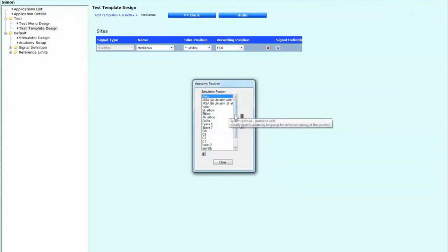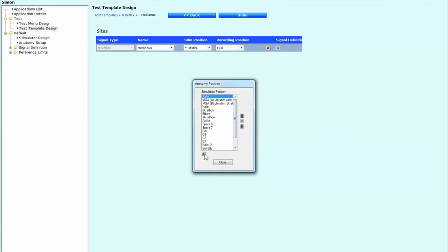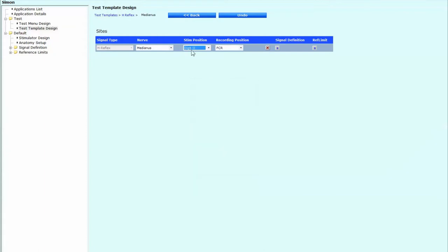Let's just edit that. And we are going to put a new one in, which is going to be finger two, digit two, whatever you prefer. And then that's in the stimulating position. Recording position here is going to be the APB.